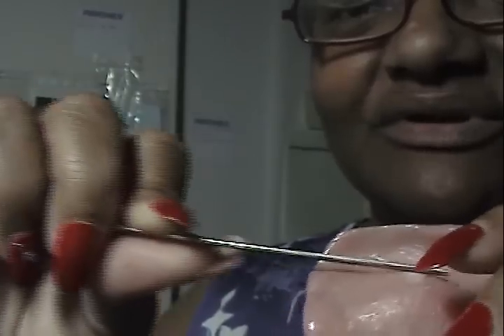So for this one, I didn't use a Dremel. I did just do this. I just watched a program and I did this for a few minutes. And I filed back and forth just like this, back and forth, because that's where it was hurting, right there. Okay, in the picture now, it looks more like 15 millimeters.